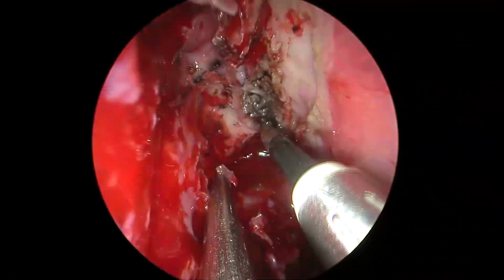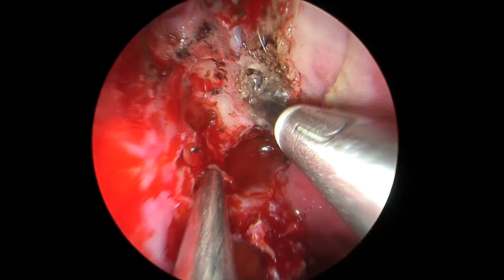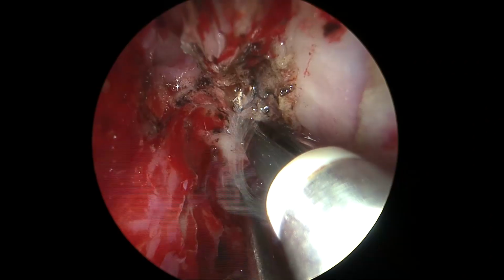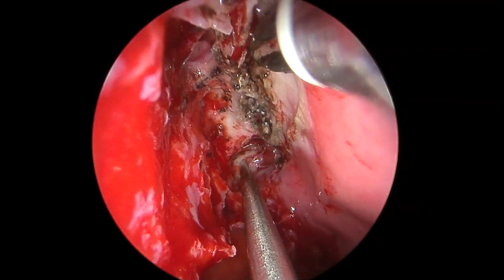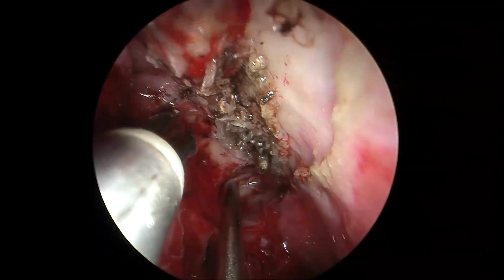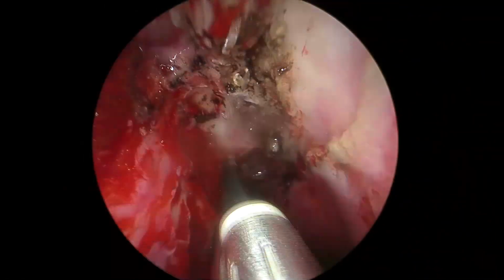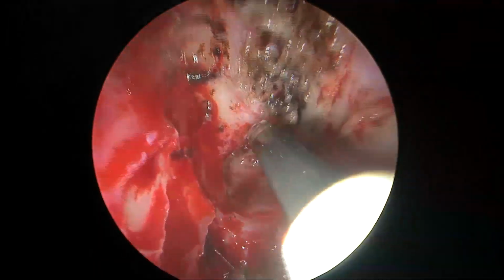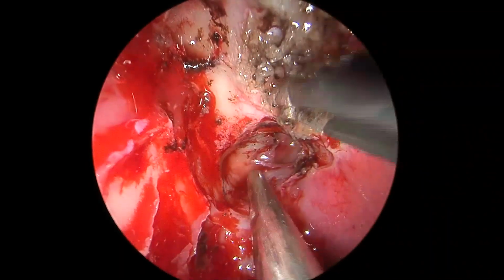Now, once this has been done, we can see how very generous we want to be in our use of the bipolar here. We do not want to keep any residual mucosa buried in this region, because if we do that, there is a possibility of future mucocele formation. These are never early complications, these are late complications. And with careful surgical technique, they are very well avoidable.